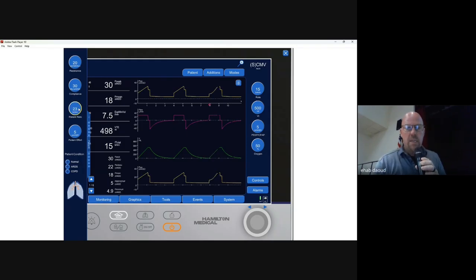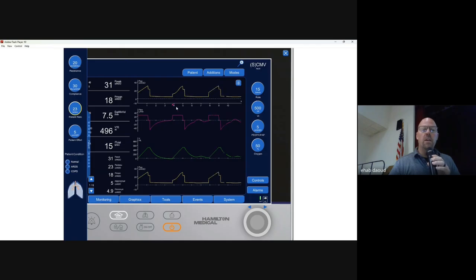And what we should see, all right, you can see the changes in the waveforms, which most of the time you may not be able to showcase with the patient, but now what we're seeing is patient activation through the simulator. So this is a patient-generated breath. This is a passive ventilated breath. Here's also another patient-generated breath. And what I want you to pay attention to, which you may not be able to show with the test lung when you're teaching, is the change in trajectories of the pressure time curve.